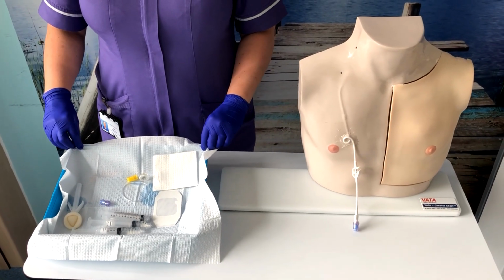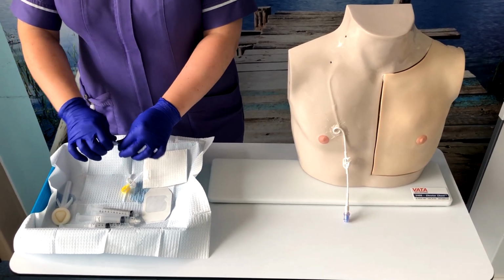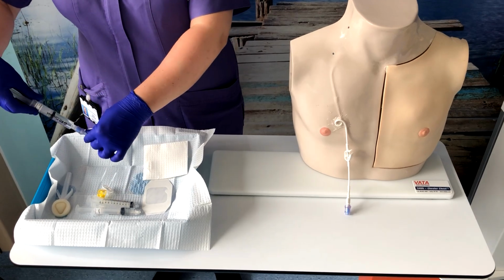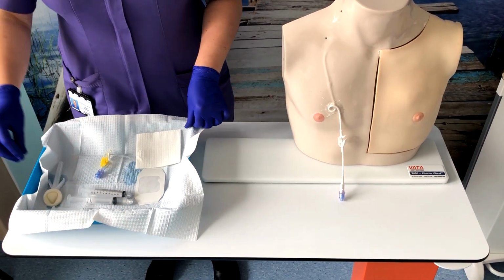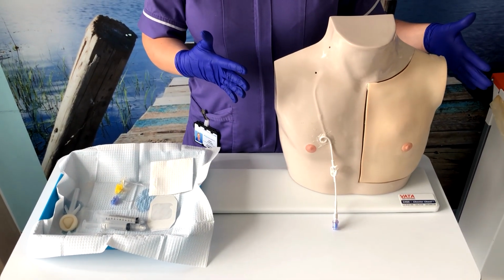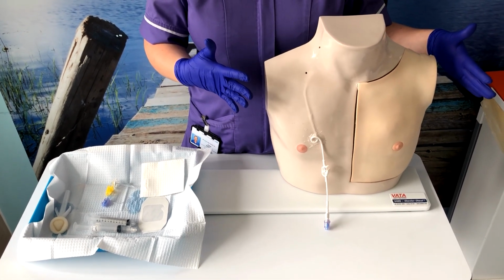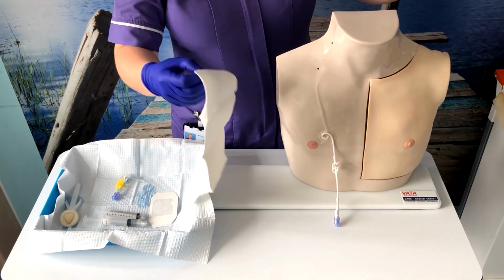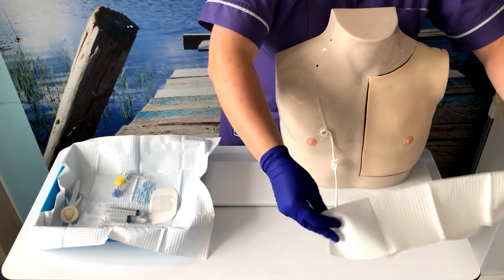So now we have our tray all set up, we're going to attach the needle-free access device and prime the needle to get rid of any air. Now for your patient, you need to make sure your patient is in a comfortable position for them, and always make sure their back is supported in case they try and lean back away from you when accessing their device. If you're doing this as a sterile procedure, make sure that you put your sterile field underneath your patient before you start.